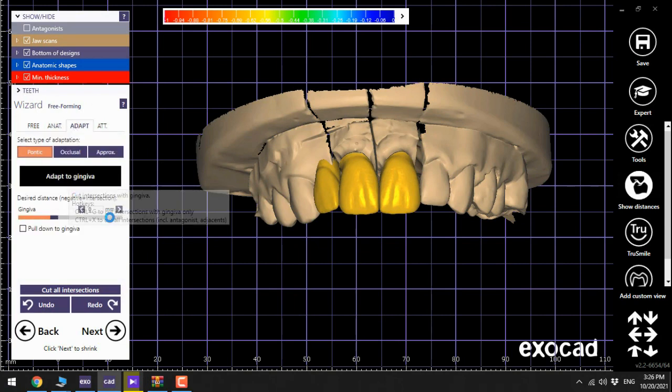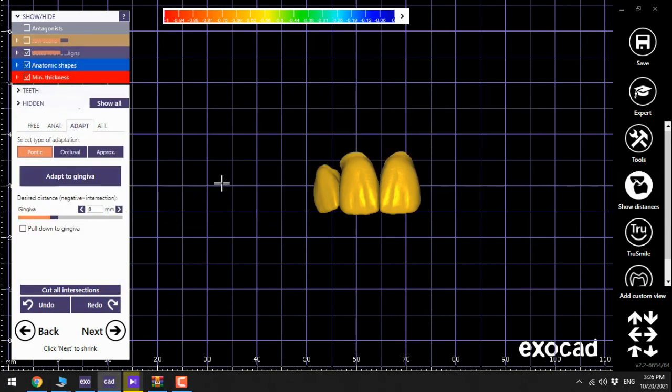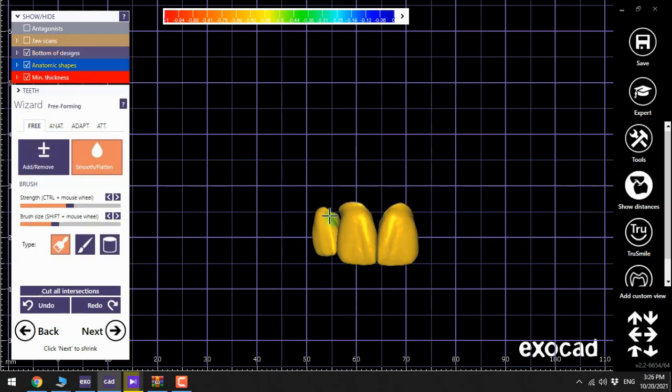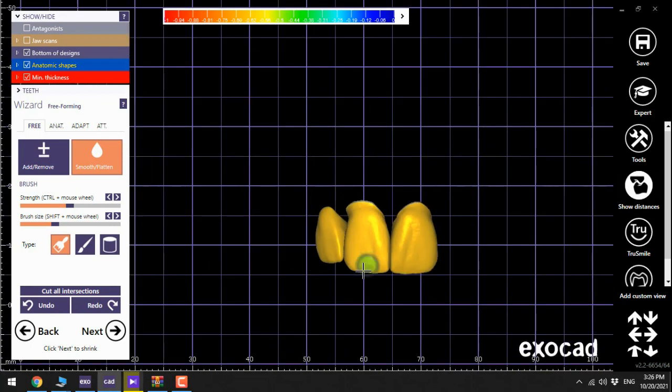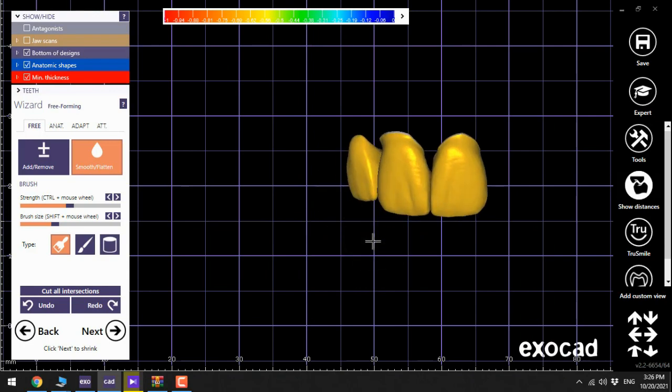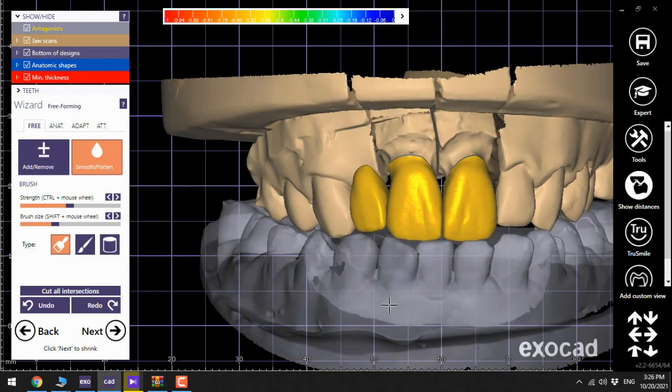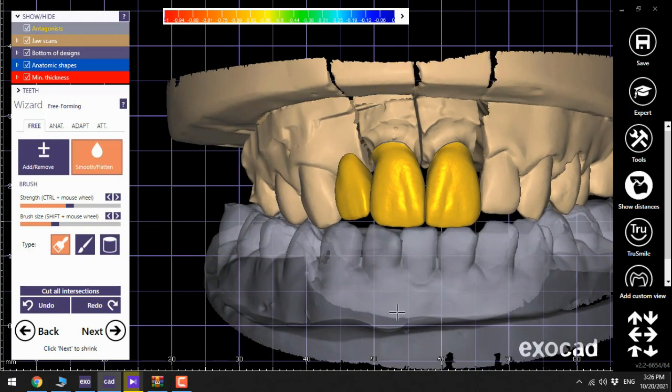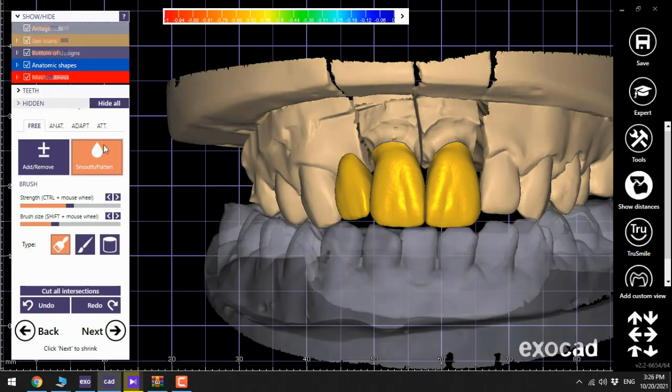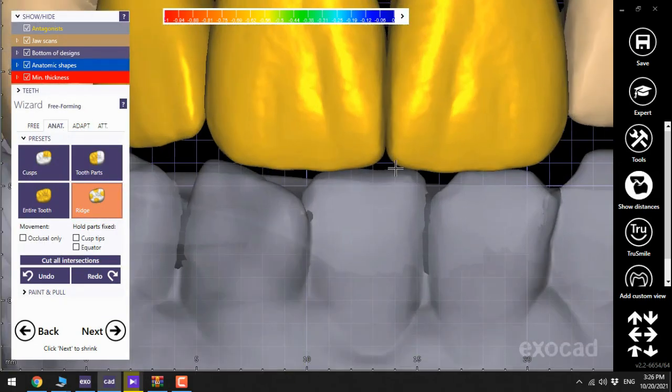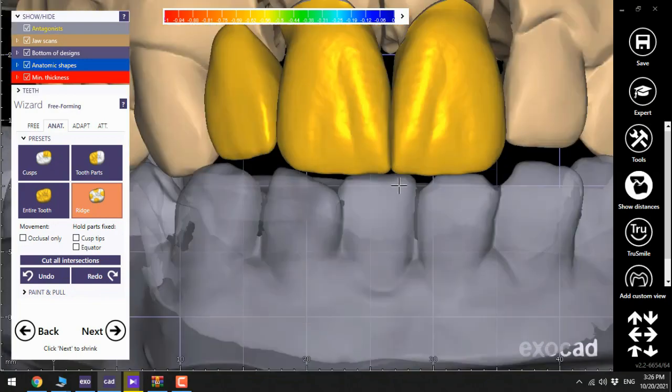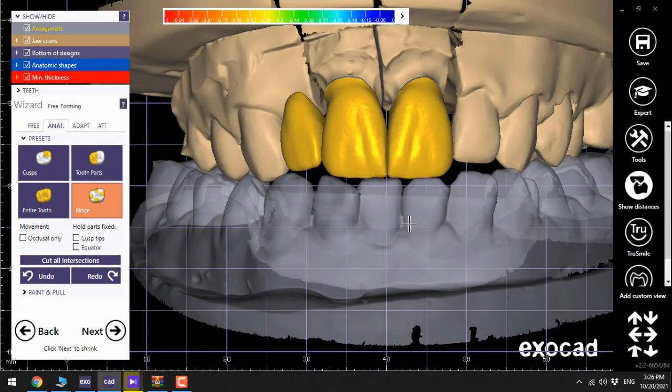Now we add up the gingiva, we try to correct the cantilever using smooth or flatten bottom. Modifying the ridge also makes a big difference in the anterior teeth.